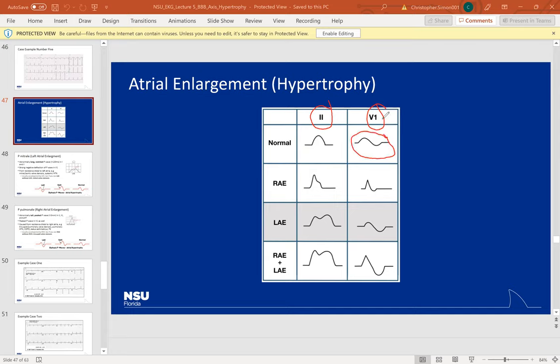When looking for atrial enlargement we're looking at P-waves in lead II and P-waves in V1. It's normal to have a nice pretty P-wave in lead II, and in V1 it's common to have what they call a biphasic P-wave because V1 is a negative deflection lead by its physiology. A biphasic P-wave goes up a little and then goes down a little. The up part should generally be equal to the down part — that's the normal presentation.